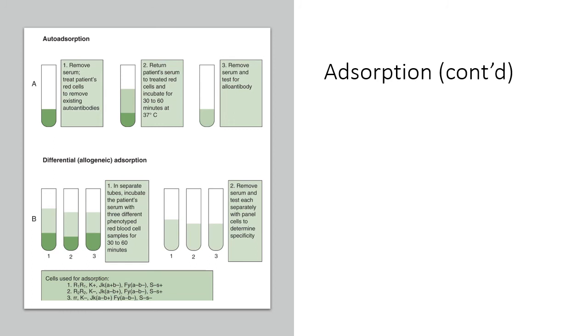Remove the serum and test for alloantibody. Okay? So that's the first time. And sometimes, like I said, it doesn't work.